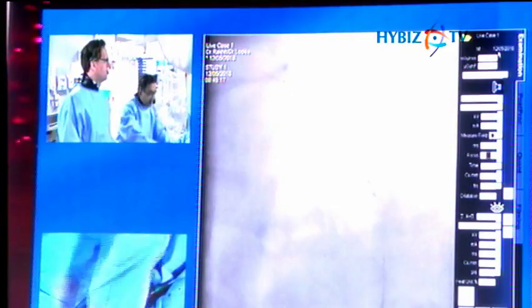Have a look. A little bit further, I think. So our proximal marker is that large first septal. We've got quite a lot of room. I'm just pushing it on a little bit. A little bit further, I think.